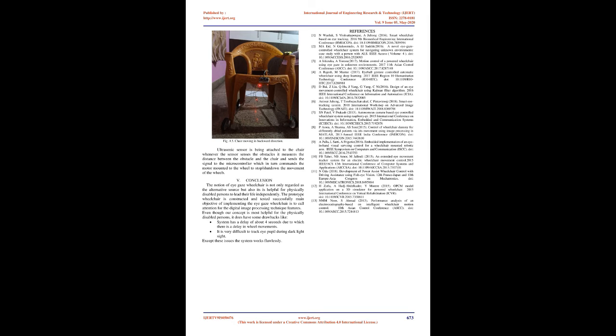The process is started by continuous image capturing with the help of webcam. Raspbian system processes image capturing, where high pixel rate image capturing cameras are being used. For result, to test the system, experimental setup is being done where small chair is being attached to the wheel which is connected to the DC motor to run in different direction.